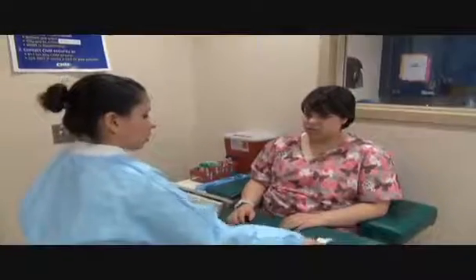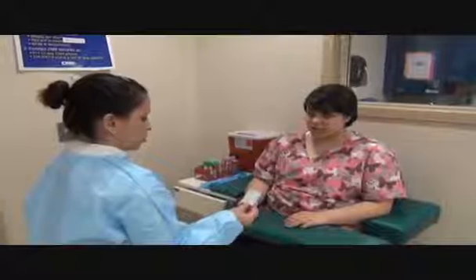Student, do I have permission to try your blood? Yes. Okay, can you please state your name and date of birth? It's Johnson Garcia, 9-24-91.